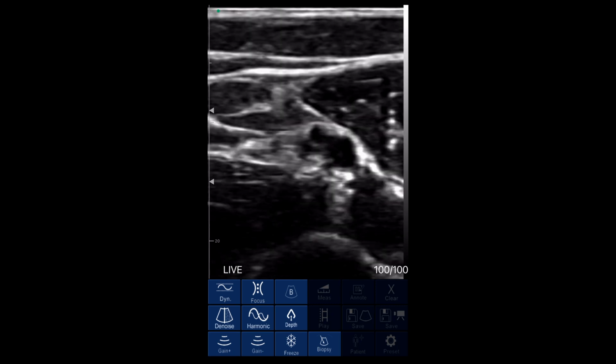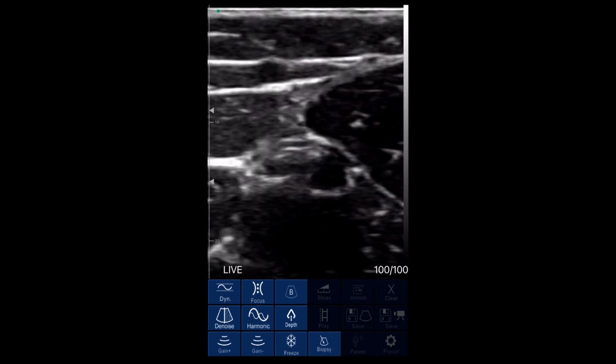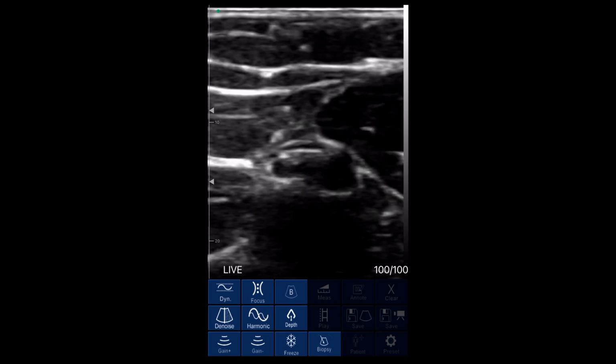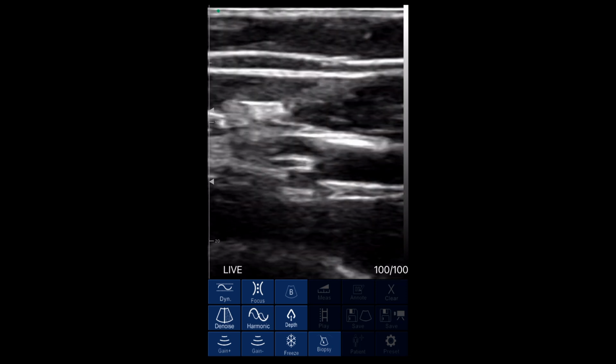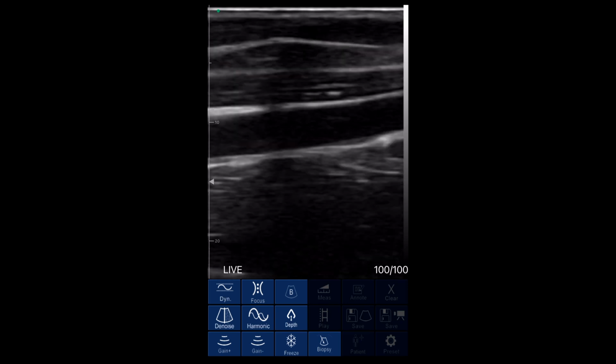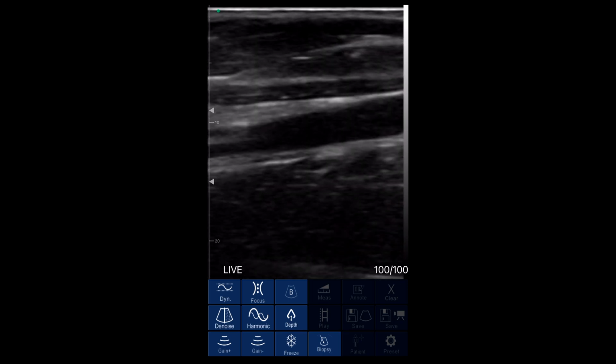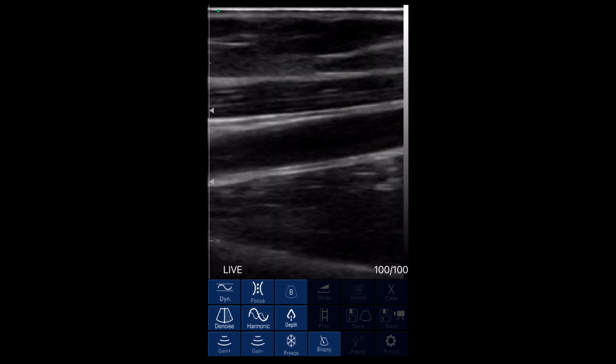And I'm just going to do a little sweep going all the way down my arm to show you how easy it is to follow that vessel and how good the quality of this probe is for these superficial structures. Here now I have just the brachial artery again in long, and I am just going all the way up from the bottom back to more superiorly on my arm.